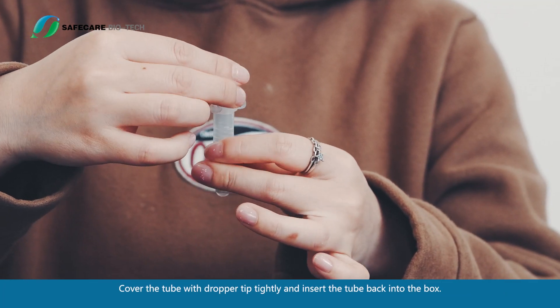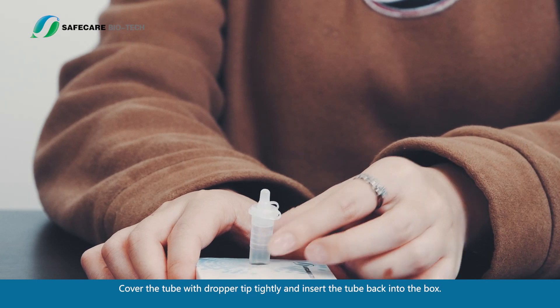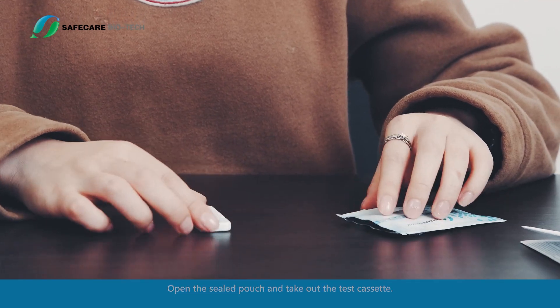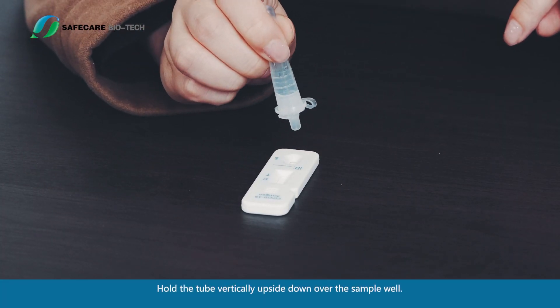Cover the tube with the dropper tip tightly and insert the tube back into the box. Open the sealed pouch and take out the test cassette. Hold the tube vertically, upside down, over the sample well.